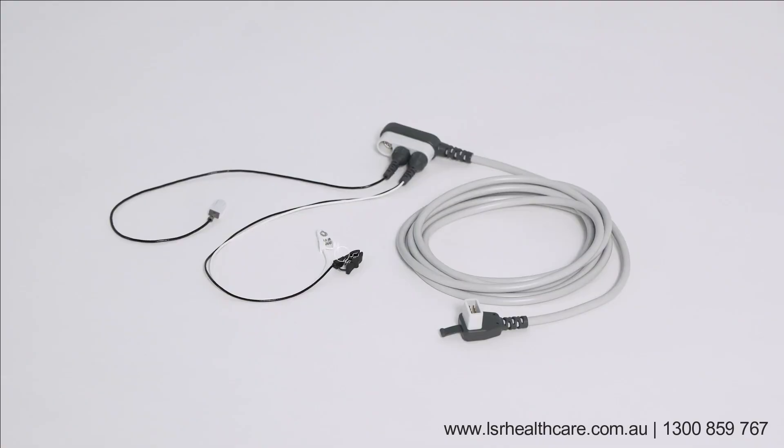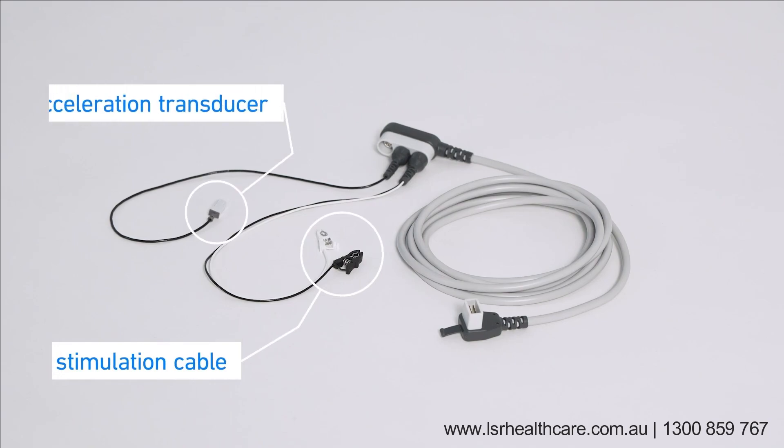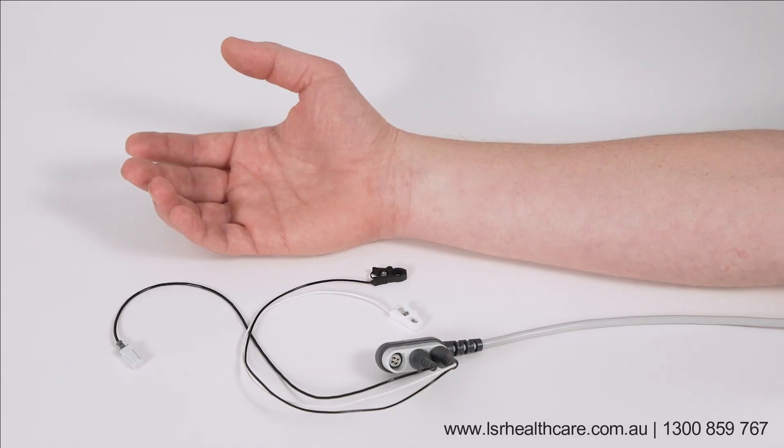The patient cable with stimulation cable and acceleration transducer. Setup for measurement at adductor pollicis.